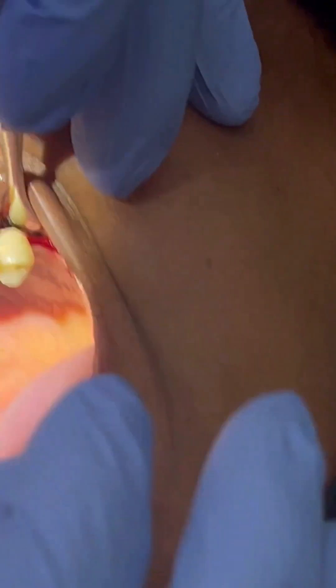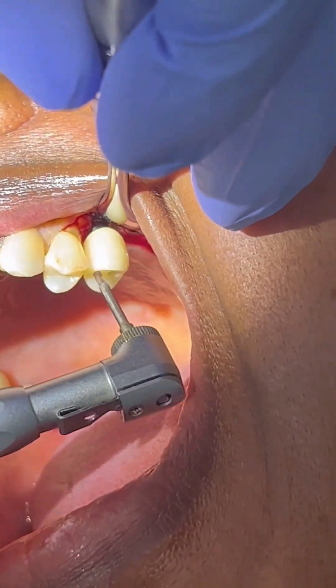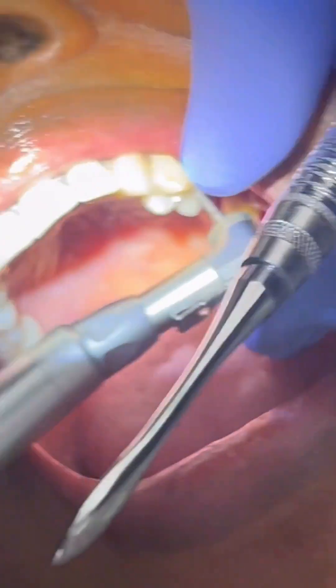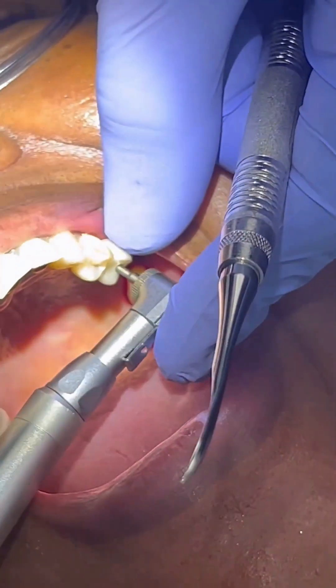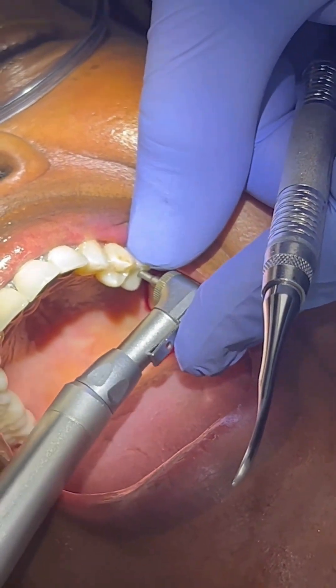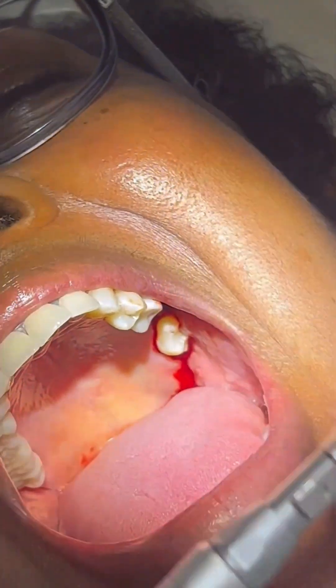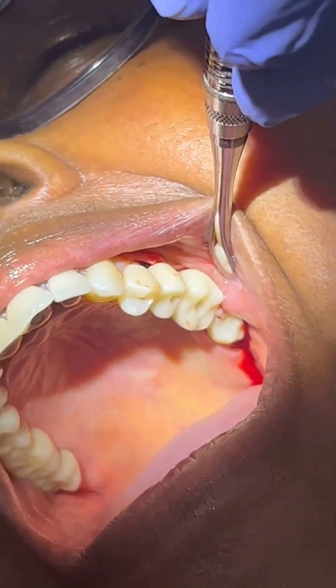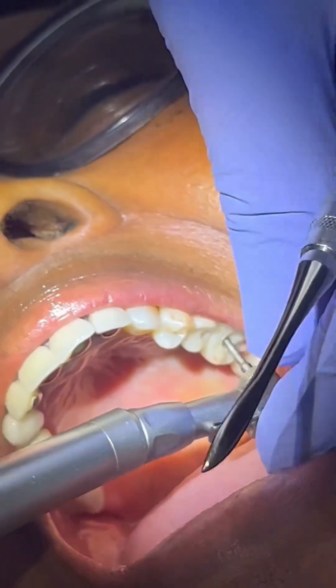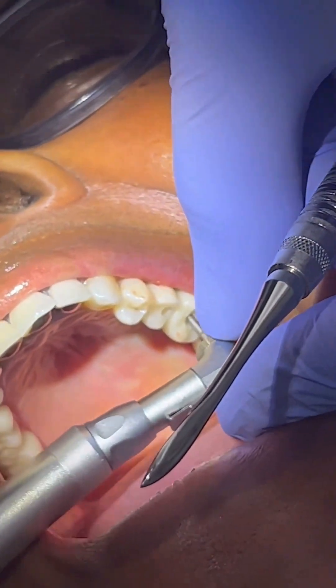For deliveries, I always start with the mesial and work my way backwards. In this case, since I'm doing multiples, I'm just going to torque this in to maybe 15 or 20 Newton centimeters — not all the way. Tight on number 14, and same thing, we'll torque this in to 15 to 20.